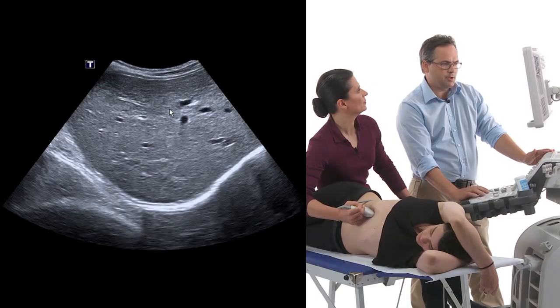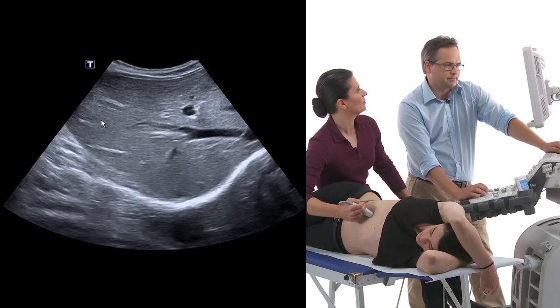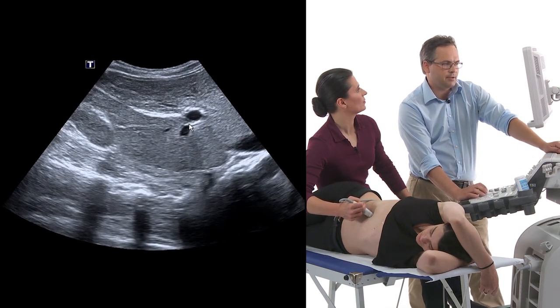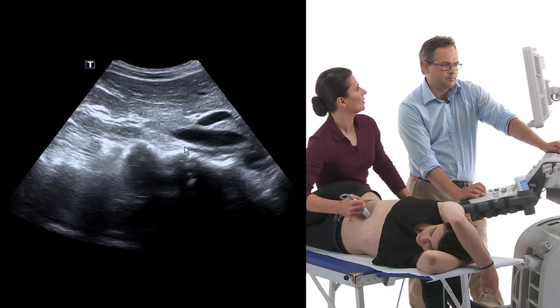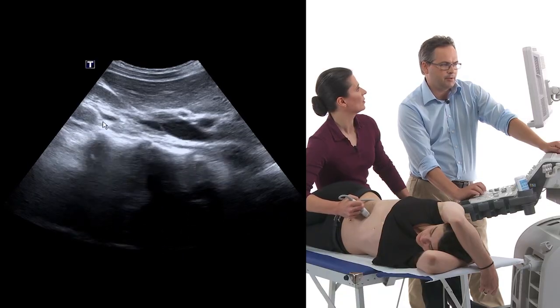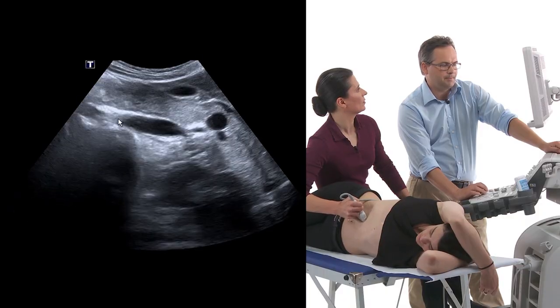So we also see the uppermost regions of the liver. Segments 7, 8, 6 and 5. And downwards. Right kidney over here. IVC.